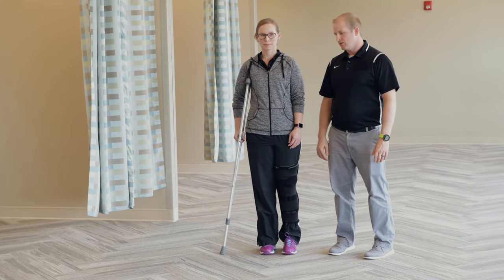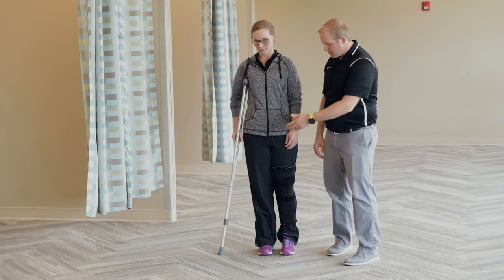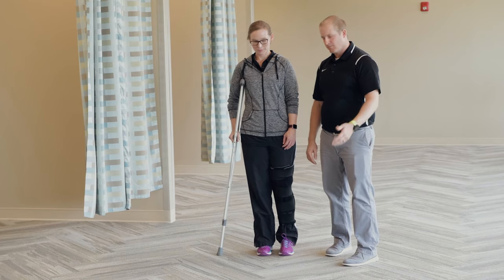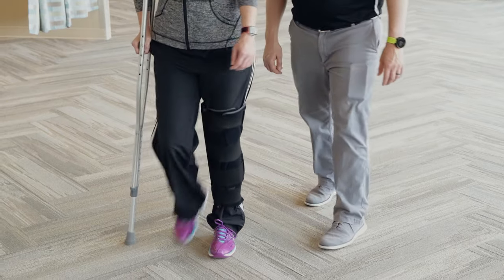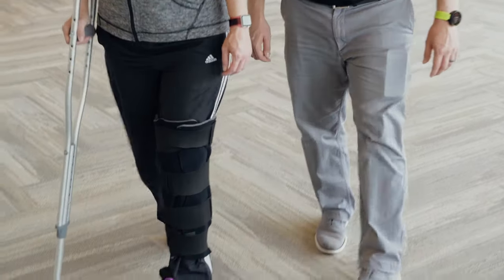When walking with a single crutch, the crutch and your affected limb will move together. You will advance the crutch and your affected limb forwards, and you will step forwards with the unaffected limb past the crutch, repeating this process.